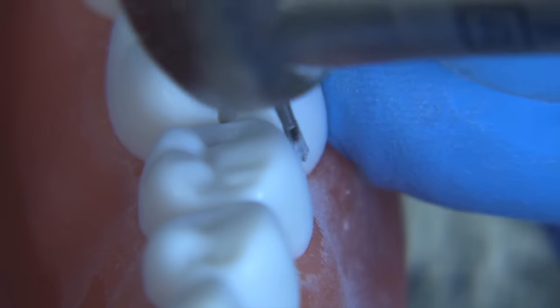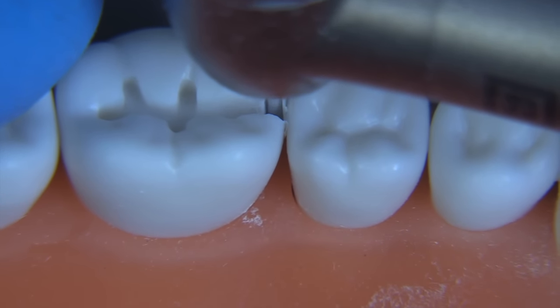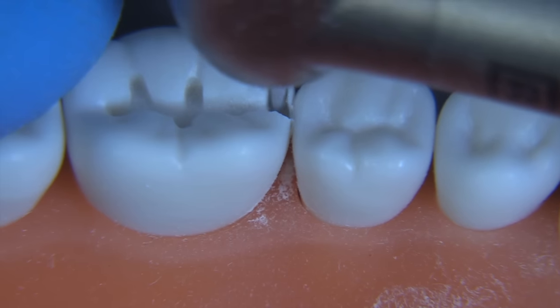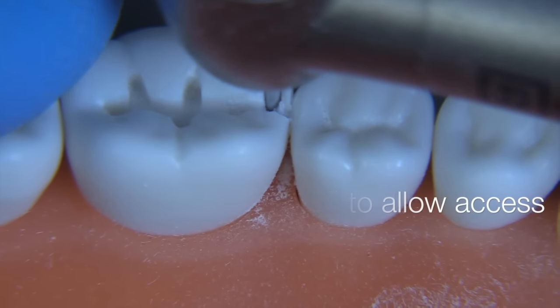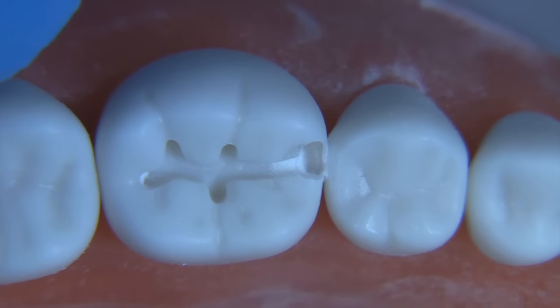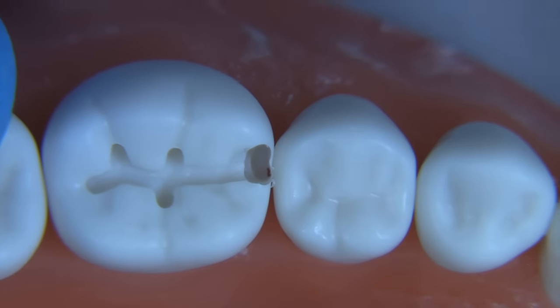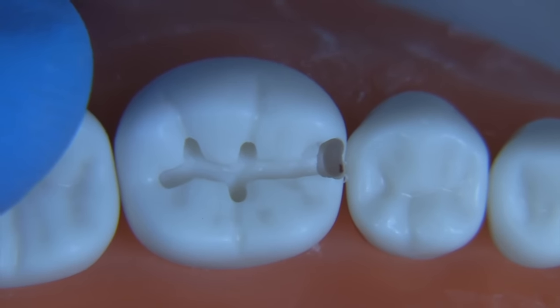When you do the box, it's good to move the bur as straight as you can so you can make a nice flat gingival, but also go a little bit deeper axially. The reason for going a little deeper axially is to give yourself access to using hand instruments later on. You don't want the box so narrow that you can't get a hatchet in there easily — or you try to cram a hatchet down and end up scratching the adjacent tooth, which I'm sure we've all done if we're too conservative with the box.